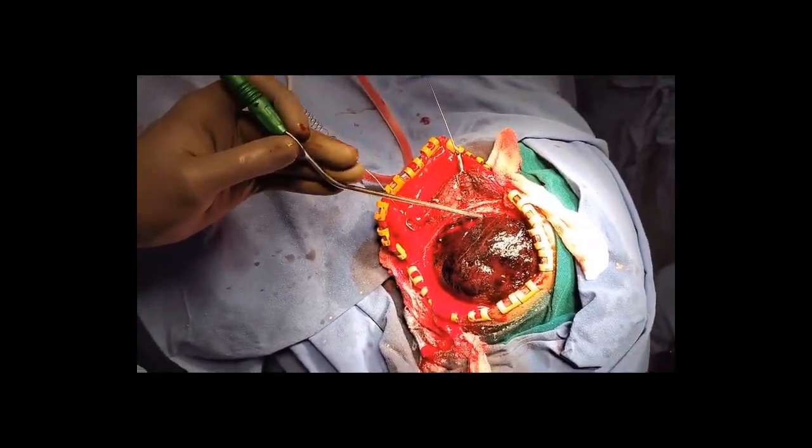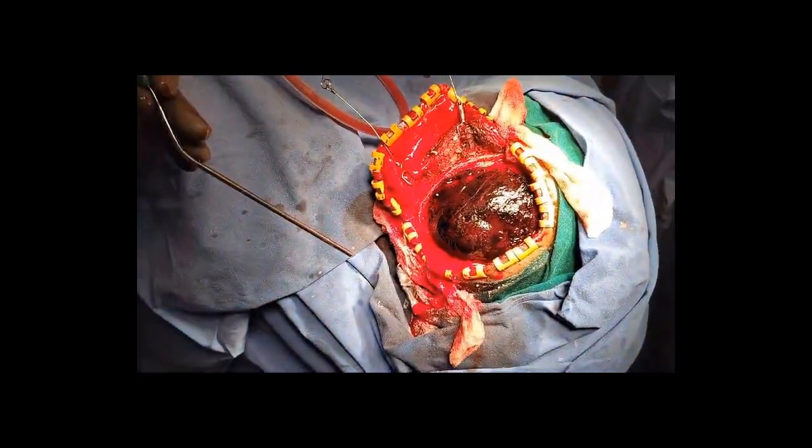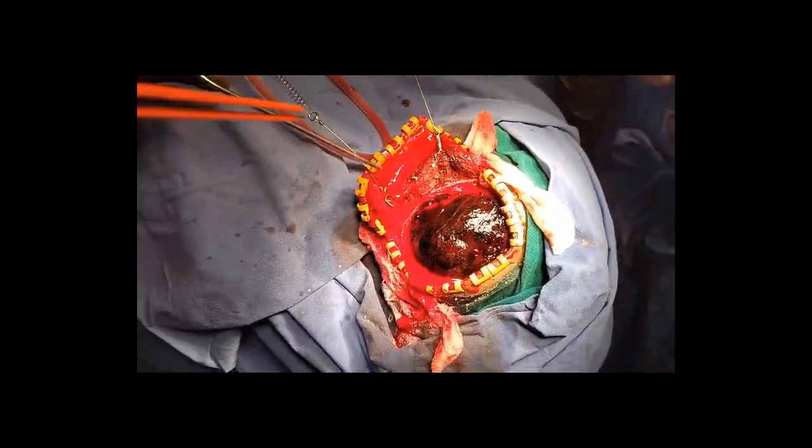You can even pause the video and see there, the fracture line which is moving across the bone. Now let me zoom in from here.